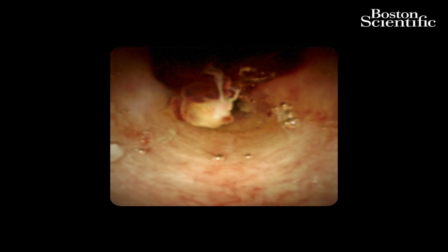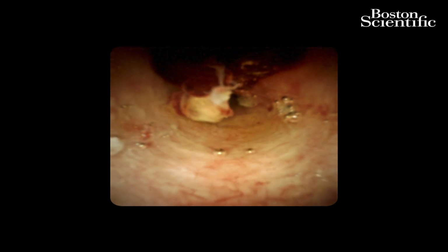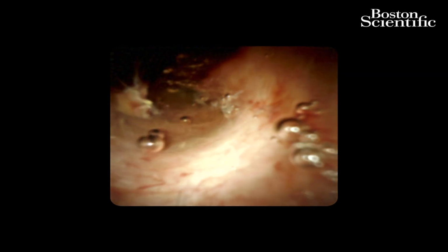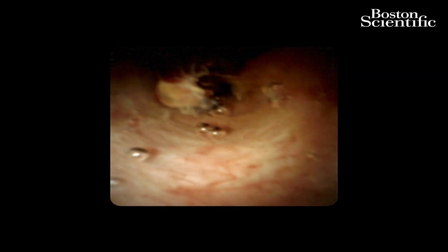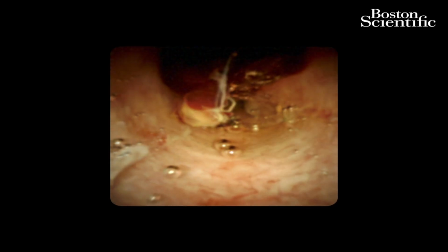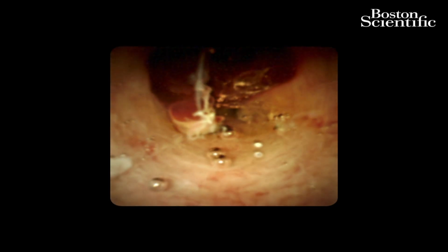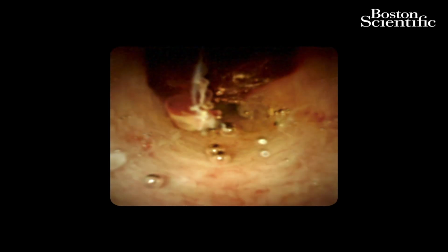These have gone through one ERCP, they did brushings, maybe biopsies, and none of that showed anything conclusive. Therefore, we may need to do the next ERCP with more tools to help us diagnose this. These tools are the spyglass or the cholangioscope.